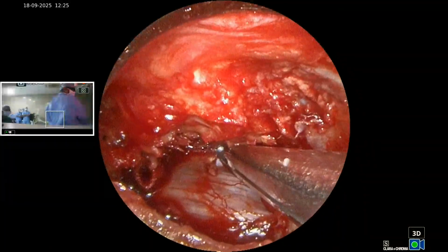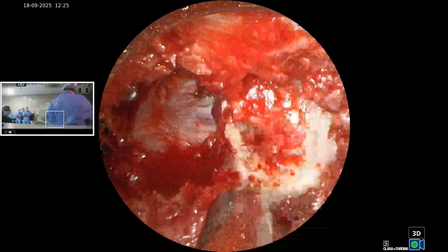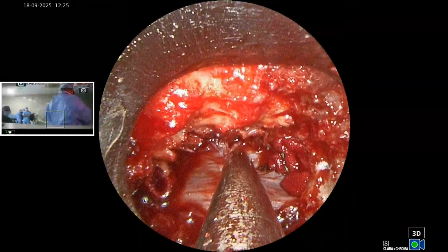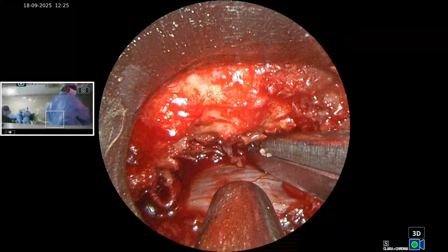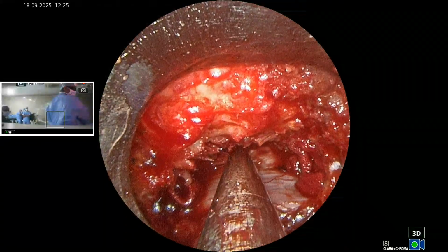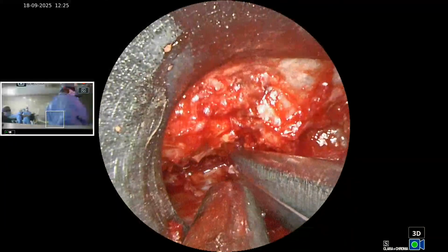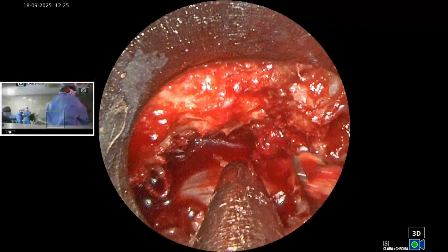This is my shoulder of the nerve root, and this is the opposite side SAP, superior articular process. There. So I just removed that hypertrophic portions of the superior articular process. This is the second bite of the bone. See this? So hypertrophic portions of SAP is removed of the opposite side.